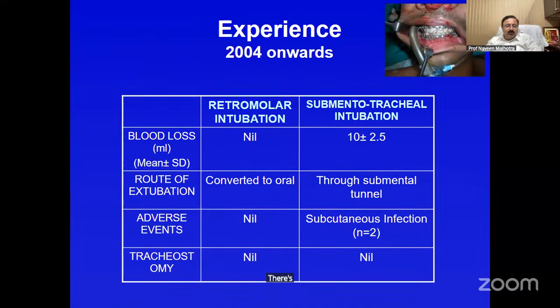There's no blood loss in retromolar intubation, and the route of extubation in all the retromolar patients was converted to oral, whereas in submental intubation, it was through the submental tunnel, and there were no adverse events with retromolar intubation.